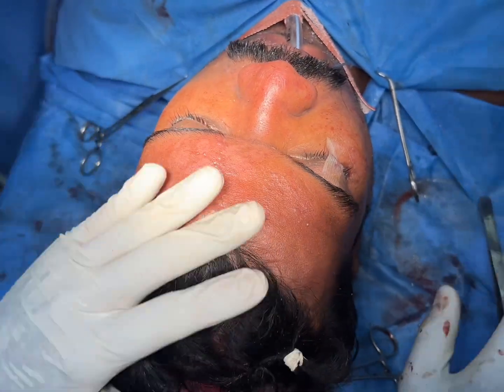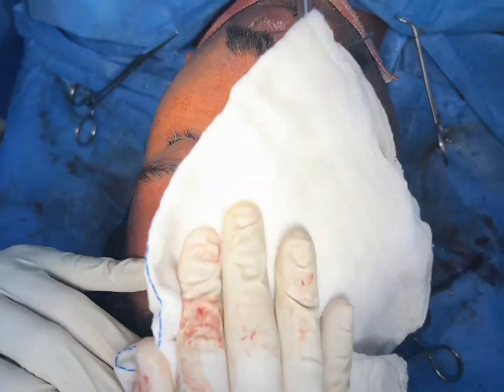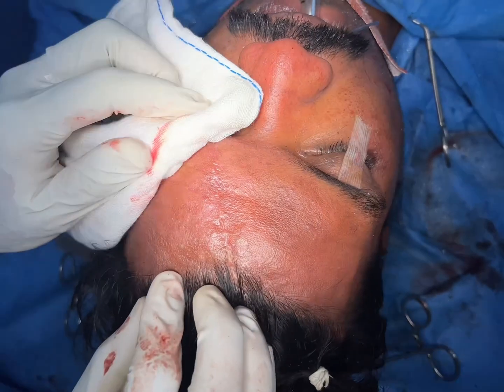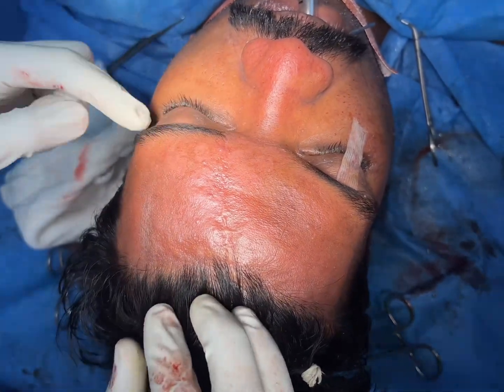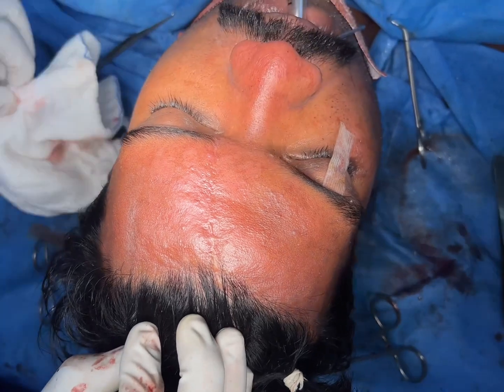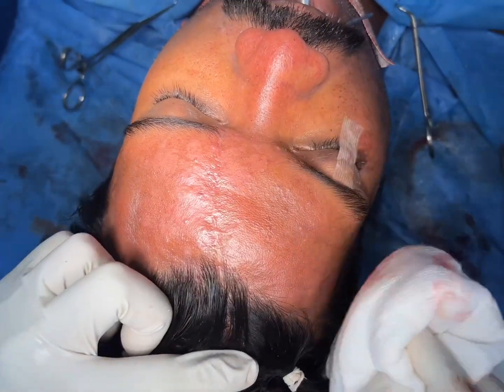You can see it's got a perfect symmetric pre-accident shape of his forehead. You can see they also worked on the supraorbital rims, especially on the right side, and a little bit the base of the nose. Now we just have to close this up.